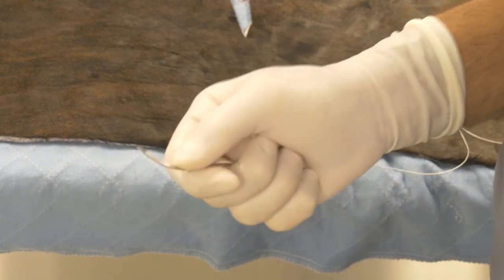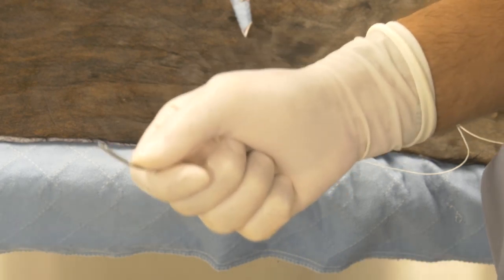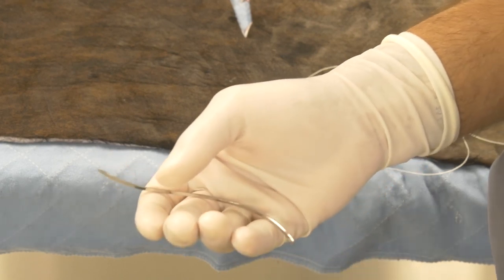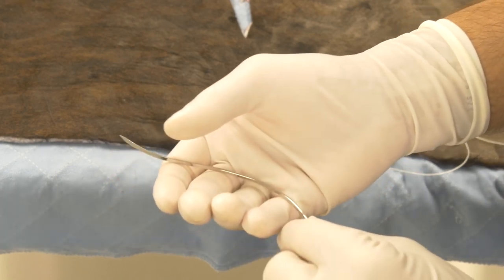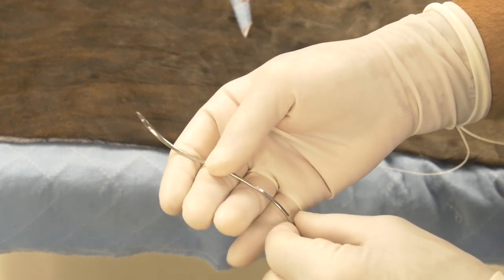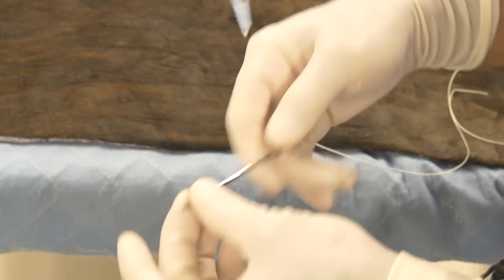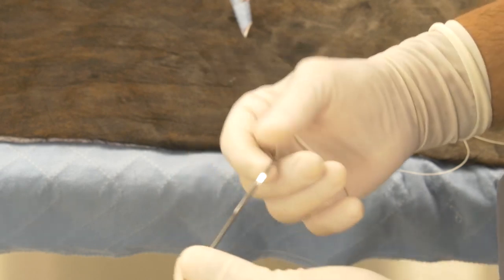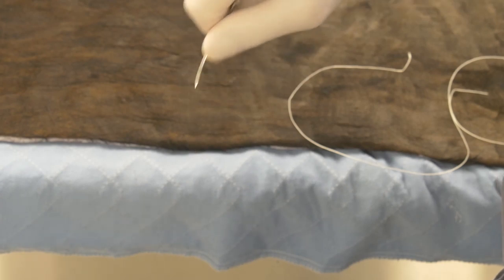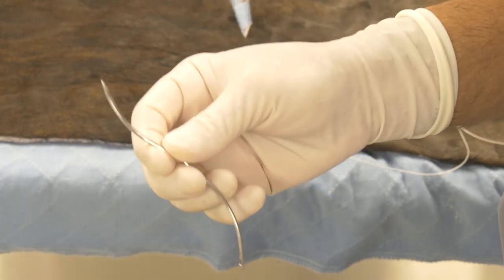Taper needles are not going to penetrate the skin of an adult cow. It's too thick, and if you try with a conventional taper needle it will tend to bend or break your needle. The other advantage of this needle is that it is very stout, making it very unlikely to bend or break as we're putting the force needed to go through the thick collagenous skin of cattle.